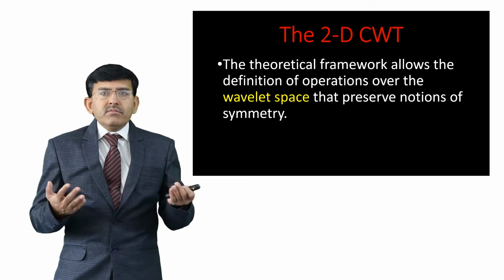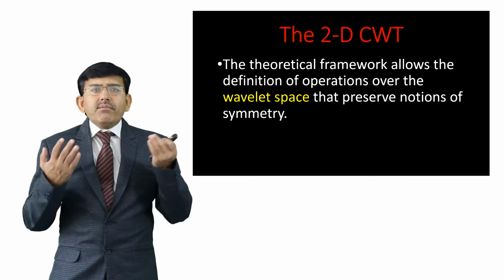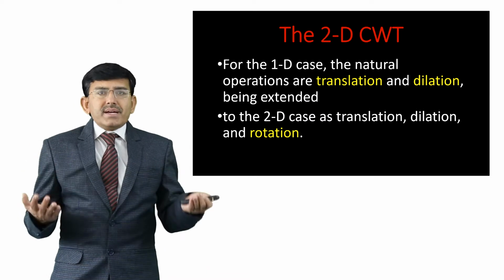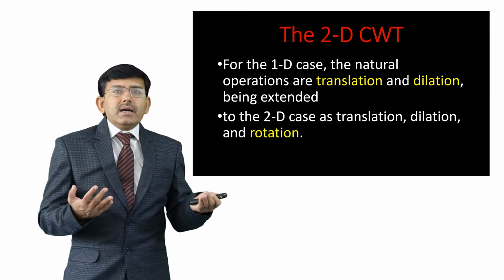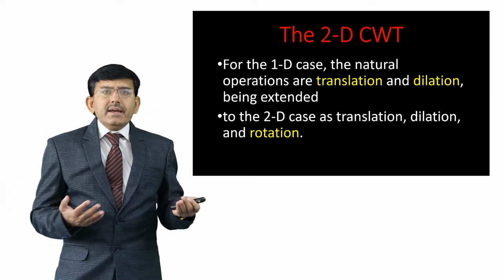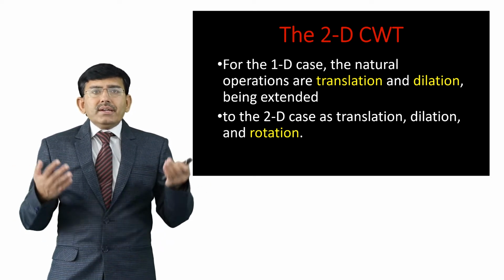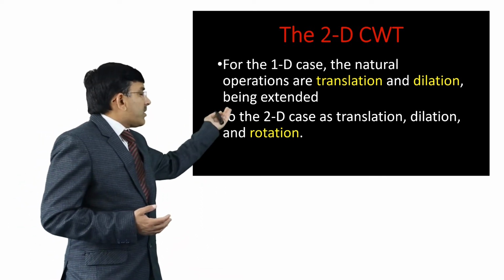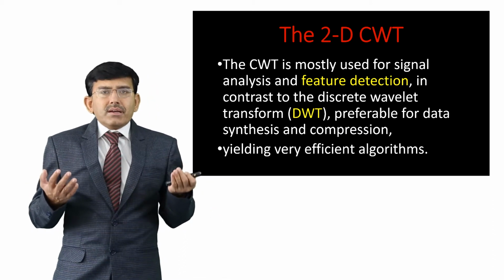The theoretical framework allows the definition of operations over the wavelet space that preserve notions of symmetry. For the 1D case, the natural operations are translation and dilation, being extended to the two-dimensional case as translation, dilation and rotation. Such transformations are implemented in the two-dimensional plane.